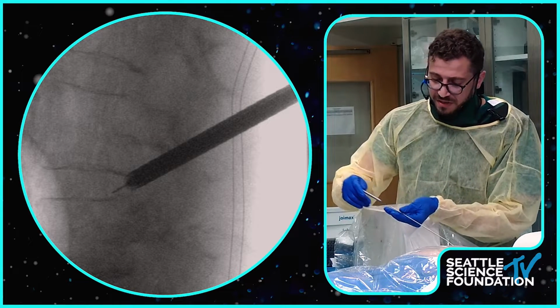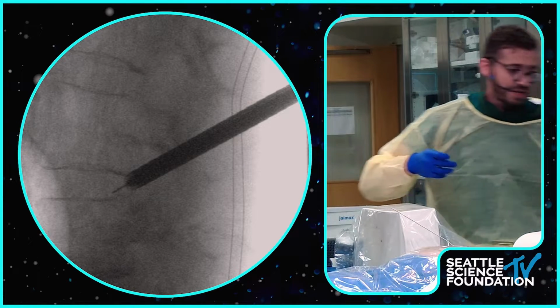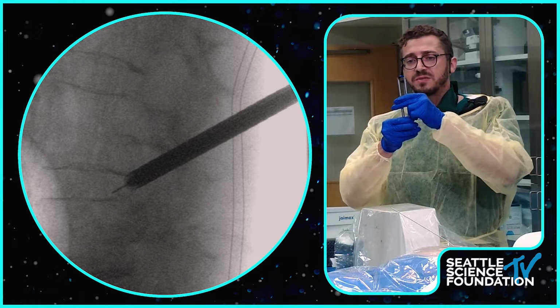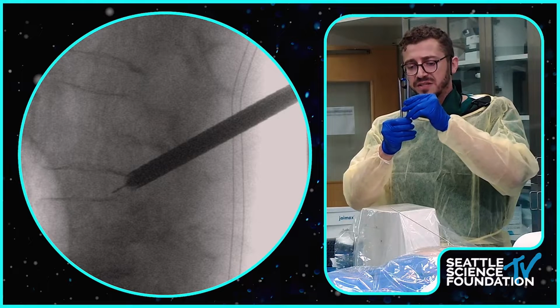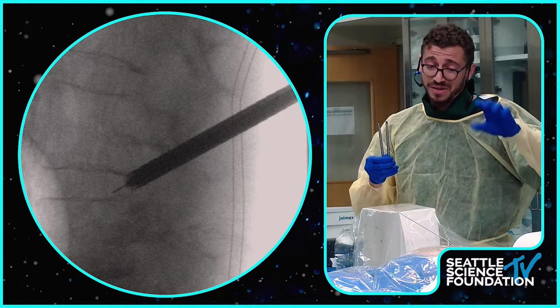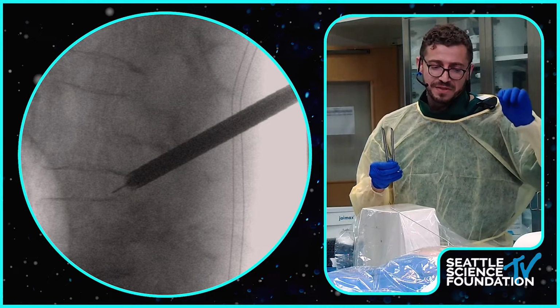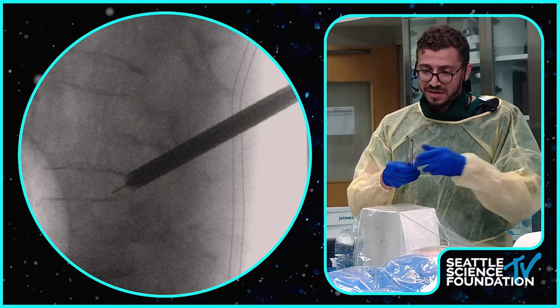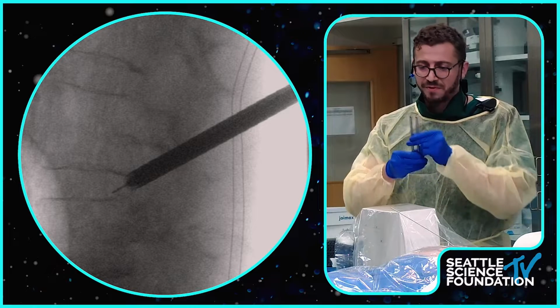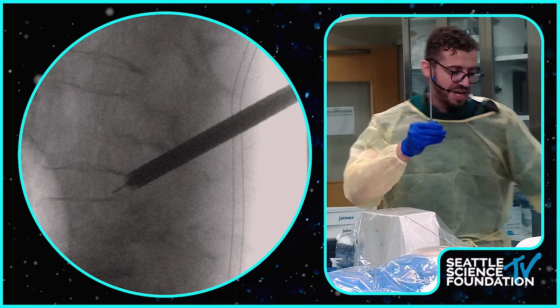Okay, so when you're putting the working channel in, there are two types of working channels here. The one that is more angled like that is for the lumbar spine. The one that's not is for the thoracic spine. Honestly, the transforaminal route is a phenomenal approach, but the game changer is for thoracic disc. I know we have a lecture and a demonstration on that tomorrow. For lumbar spine, usually use the one that's more tapered.